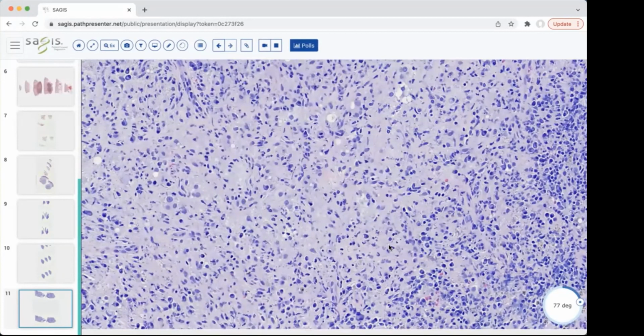I know that the quality may be lacking just a little bit, but granulomatous dermatitis is always interesting. And I think the low power is so important if you can try to fit it into one of those categories. Just appreciate that granulomatous processes can be inflammatory or neoplastic, and always keep the clinical in mind.